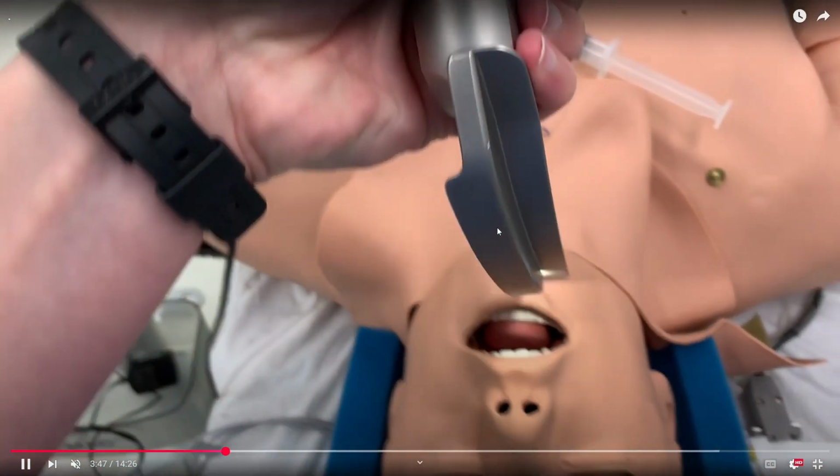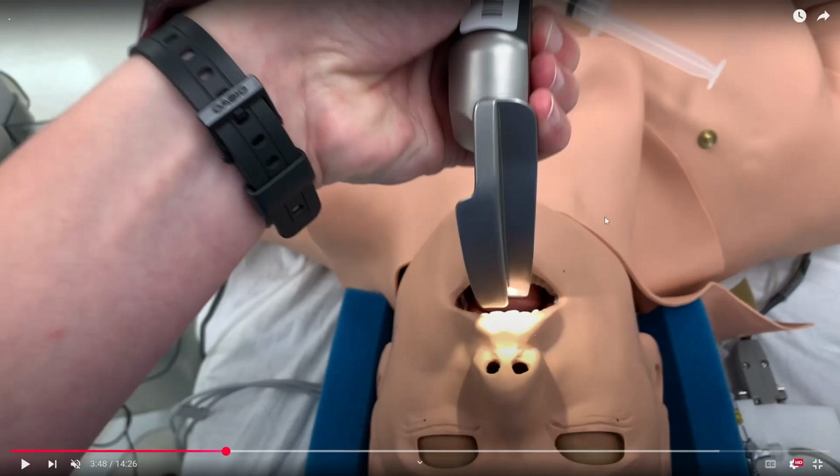And I'm talking about this right here. In reality, my right hand that is currently holding my camera would be right here, scissoring the jaw open to increase the mouth opening distance and ensuring that I don't chip a tooth on the way in. Okay? And again, another thing that's not realistic is you'd want to sweep the tongue out of the way using the blade, but because this is a rubberized tongue that does not flop around, there's effectively no need to do so. Is it good practice? Yes. Is it impractical when filming one-handed? Also yes.